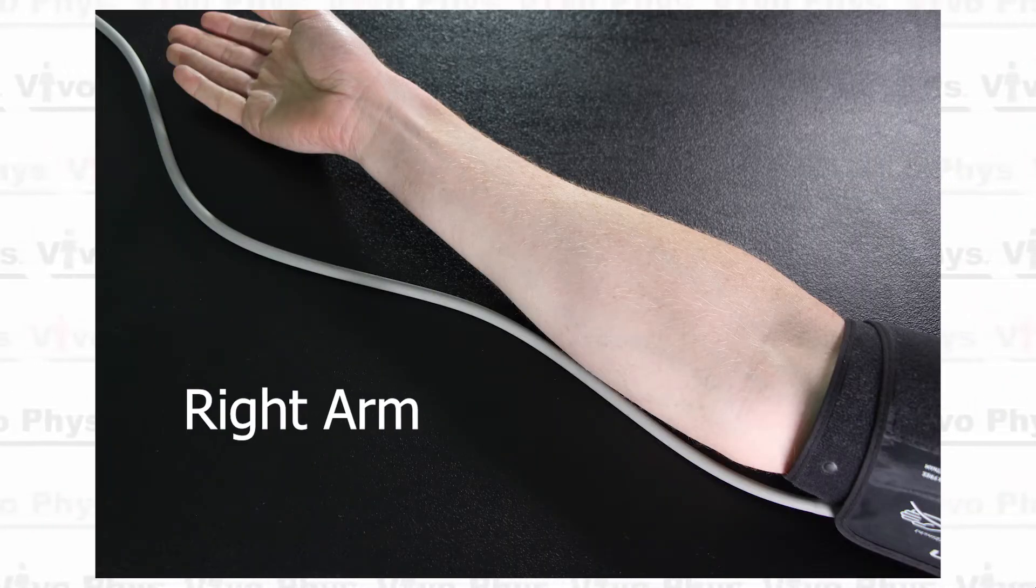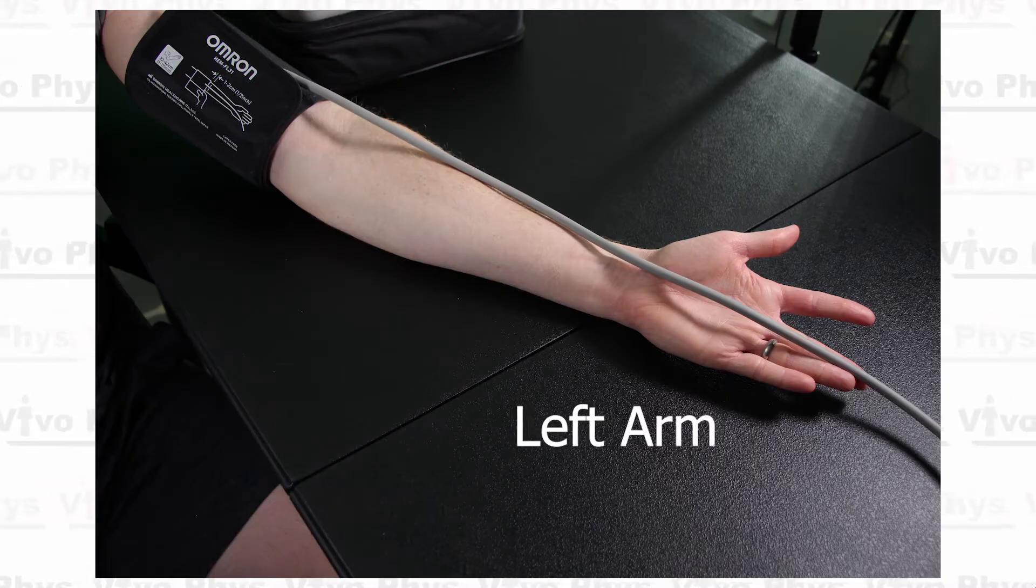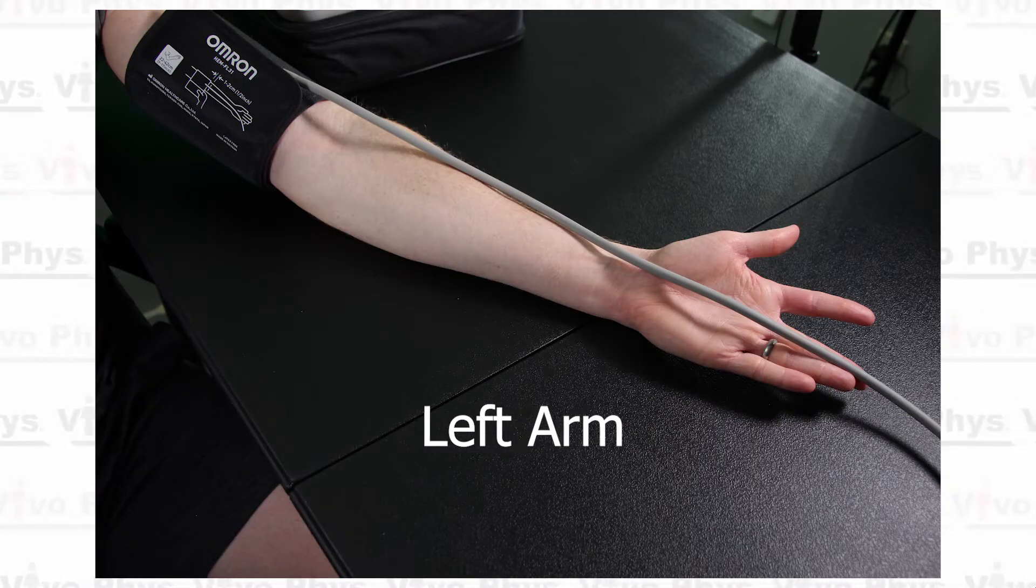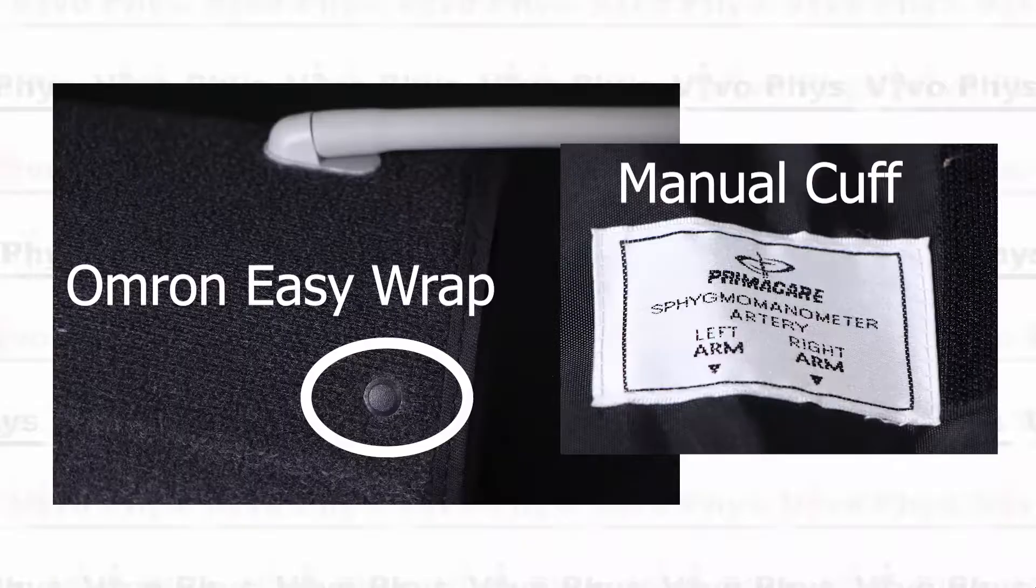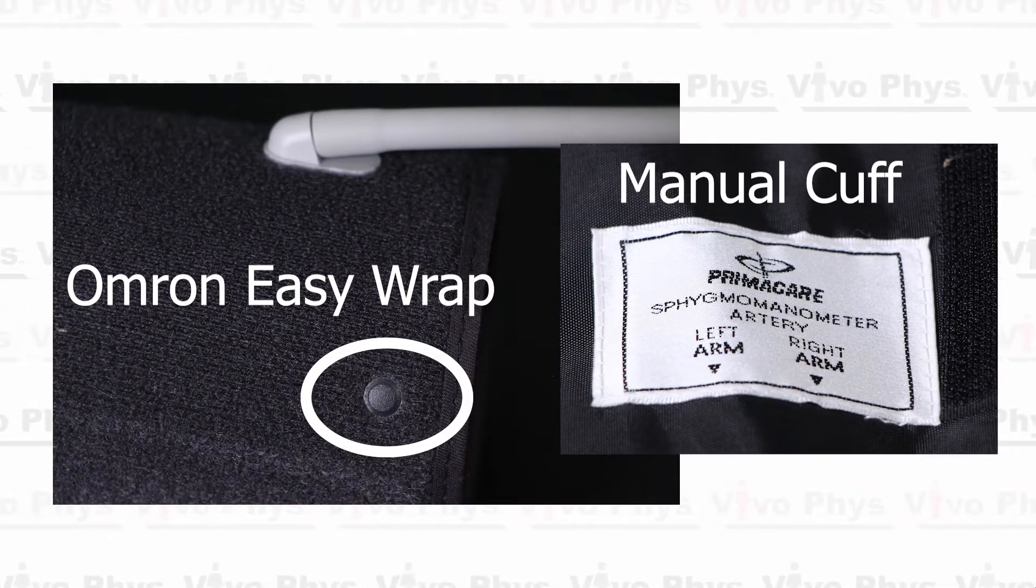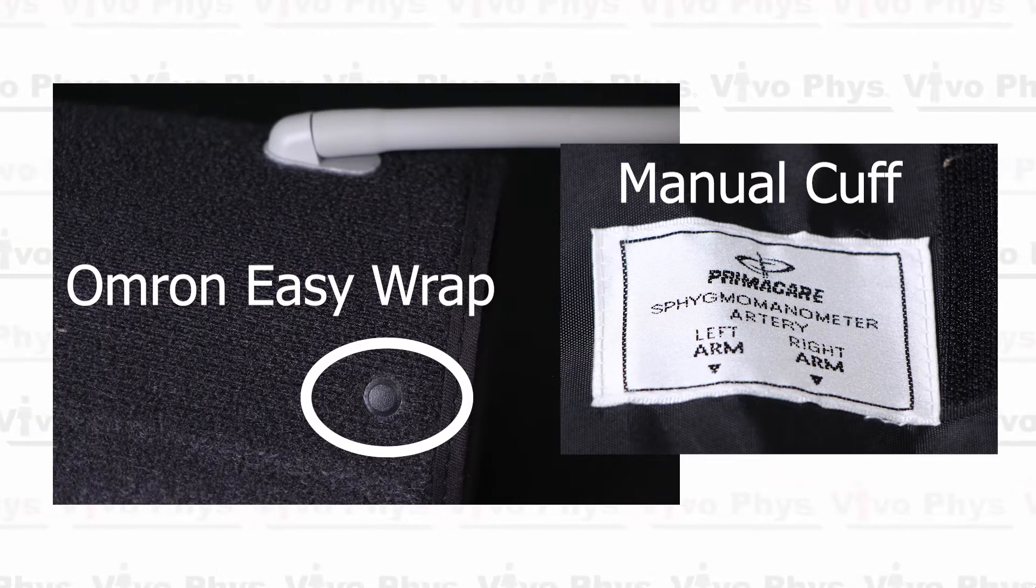So this is different from doing it on the left arm. The right arm, the air tube has to be almost under the arm where as with the left arm you want the air tube to go on top of the arm. Regardless of which arm you're choosing, make sure that the artery symbol on the cuff is on top of the artery in your arm and this is going to be just to the inside of the end of the biceps brachii, so your biceps muscle.